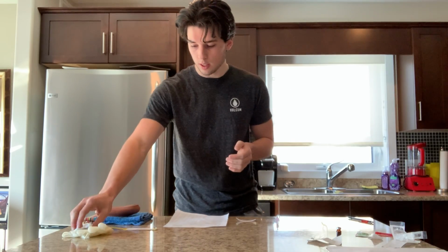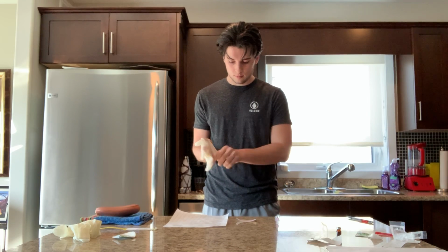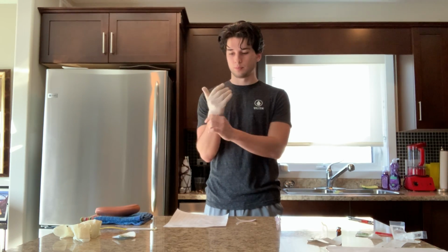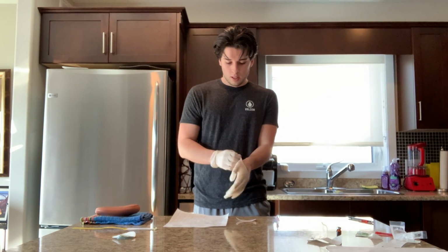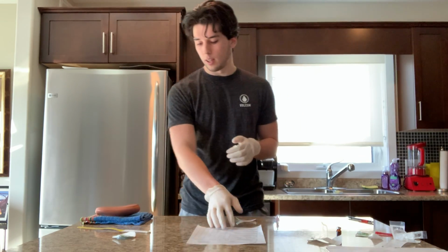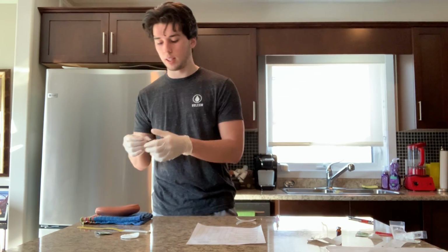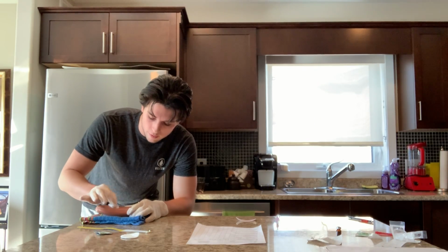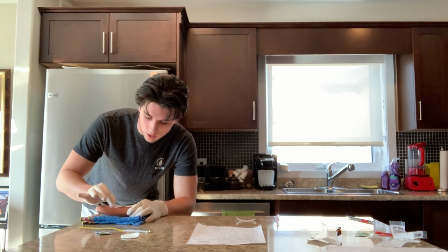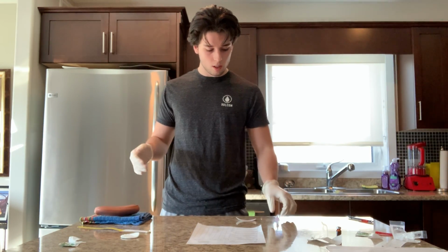So I will start off by putting my gloves on. So I can set this aside and I'll put on my clean gloves. And once I have my gloves on, I'm ready to go. I'm going to grab an alcohol swab and I'm going to clean the area that I have chosen in the abdomen here. So I'm going to clean working in a circular motion outwards for 30 seconds. So then we're going to say that that's been 30 seconds, then that can just be thrown out. And once it's had time to dry here, we're ready to inject.